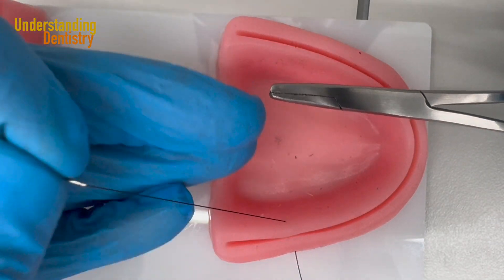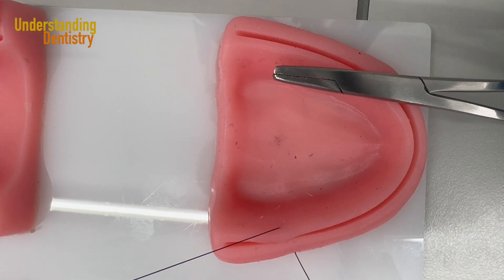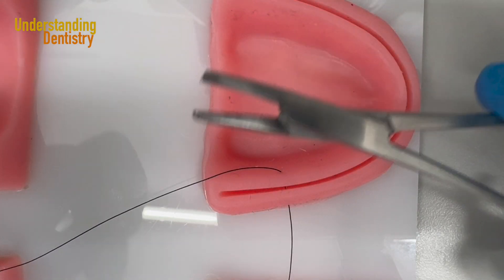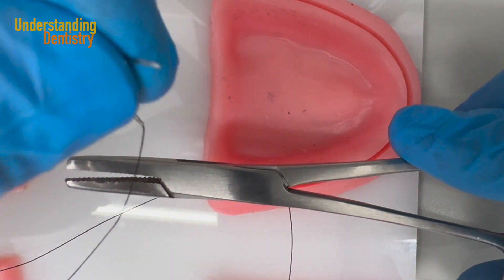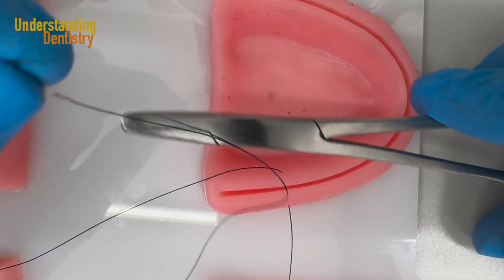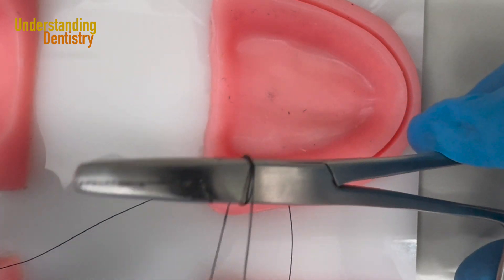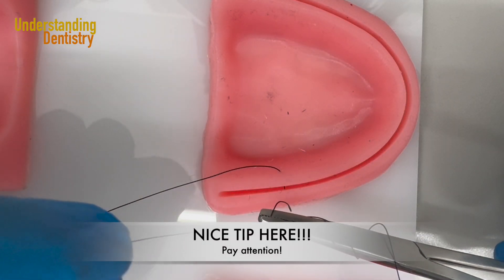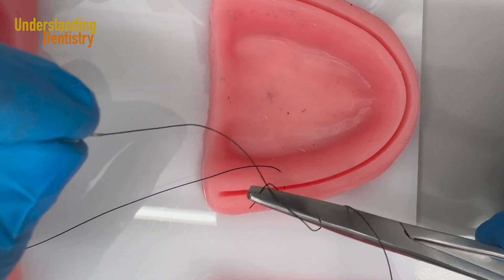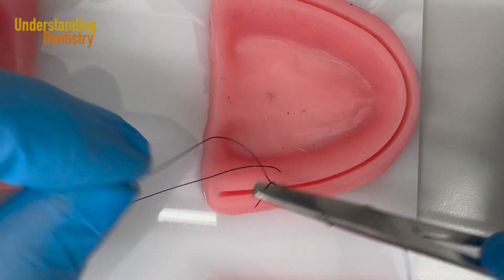Now I need to pull the thread, but of course there is the tongue of the patient. I'm going to use the other hand and fingers to help pull the thread, surrounding my fingers with the thread to avoid the needle going far from my surgical field. I'm pulling the thread now. I'm holding the needle with one hand and the needle holder with the other and I will do one, then two rotations clockwise. I grab the tip of the thread and pull — but I pull with the hand holding the needle, not with the needle holder hand.